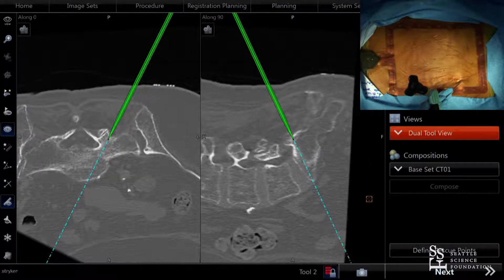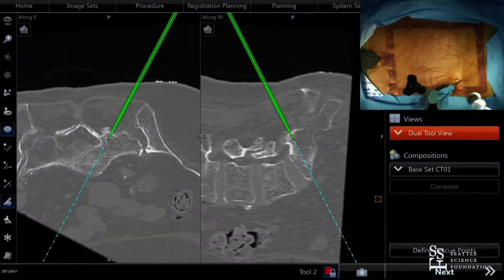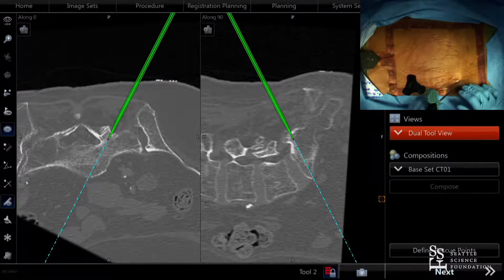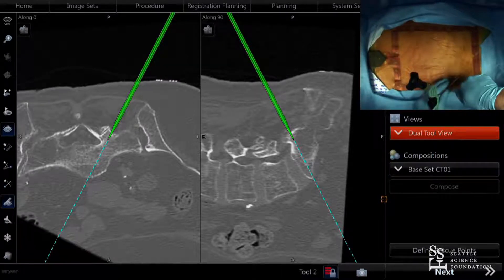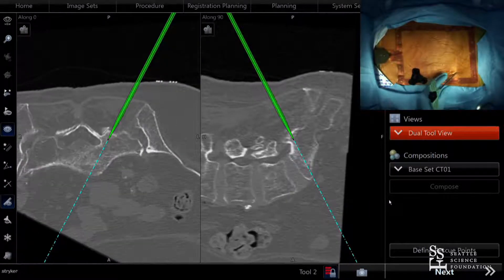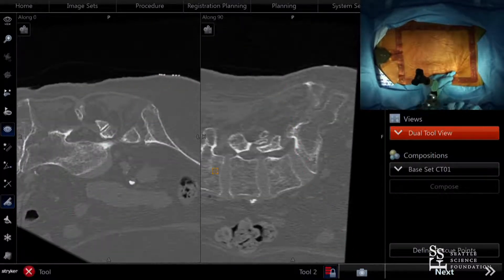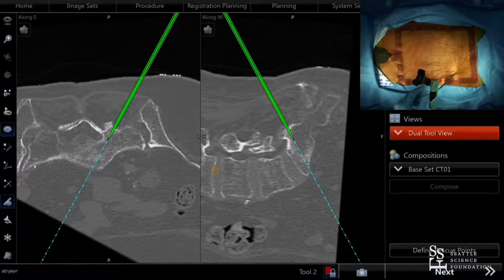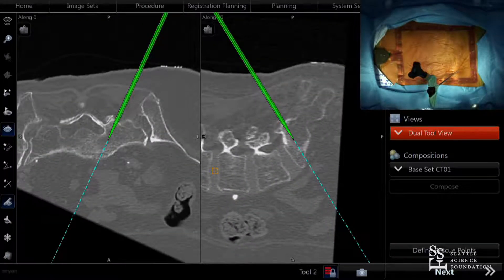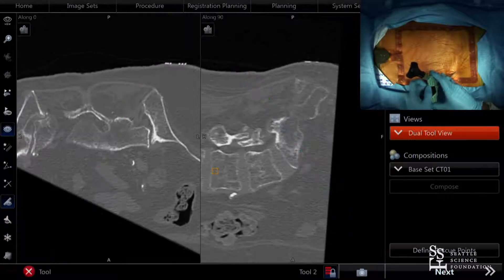Not so much in a cadaver, but I like to let go of the Jamshidi after every several millimeters and make sure my trajectory is what I think it should be. In a live patient, if I let go and it starts to sway laterally, I really have to hyper-exaggerate the medialization of the pedicle screw. I'll go ahead and tap the Jamshidi in while watching it on navigation. I can feel the change in the bone as I enter past the pedicle toward the vertebral body.